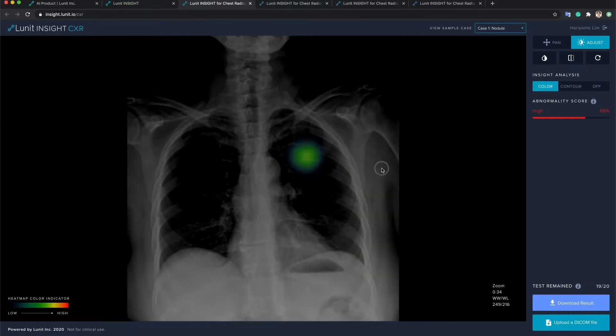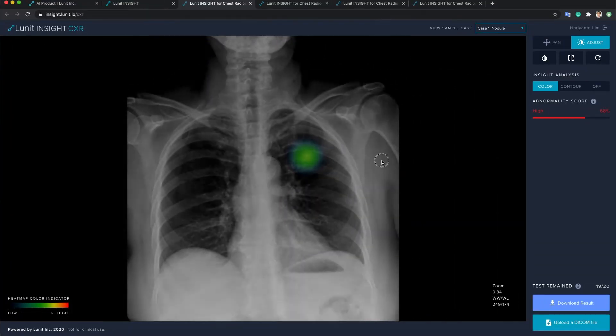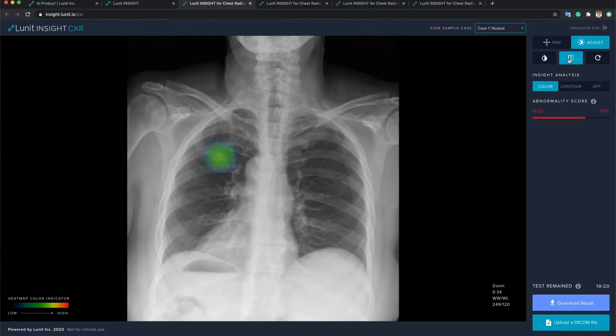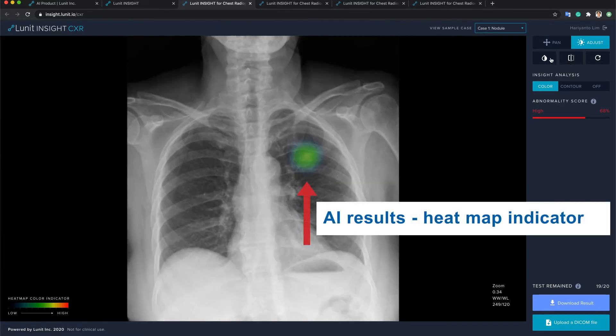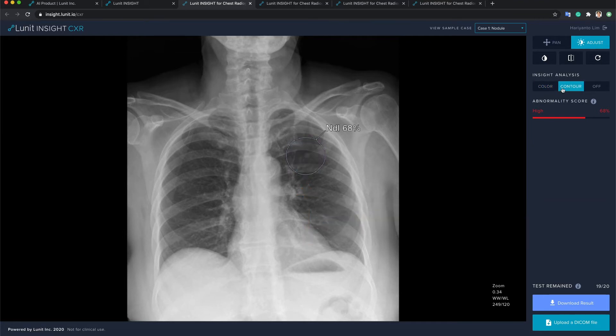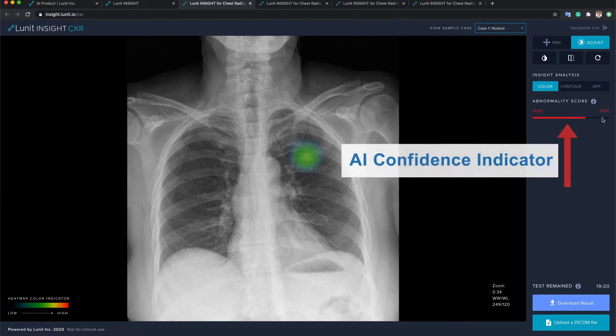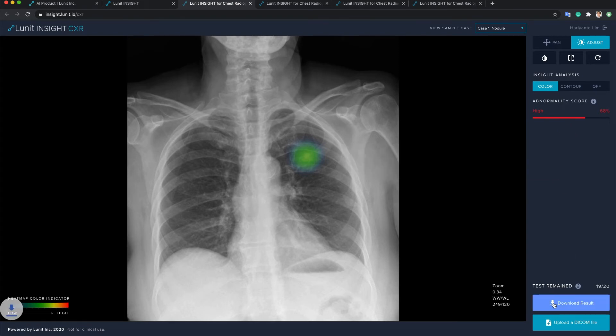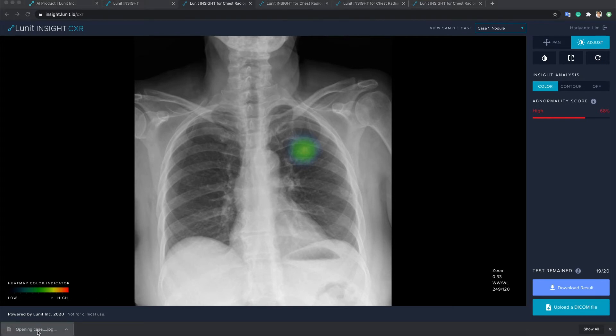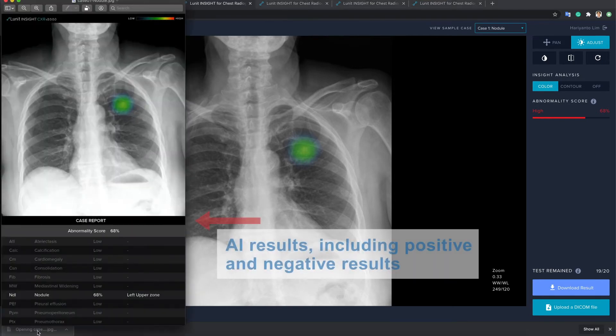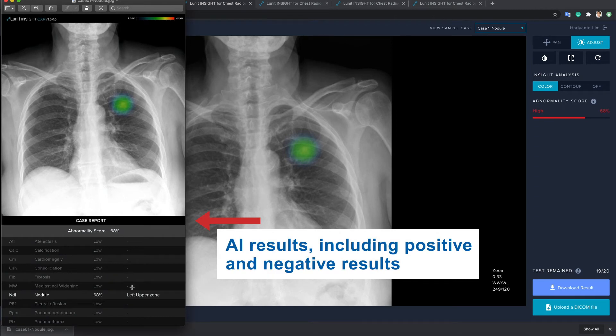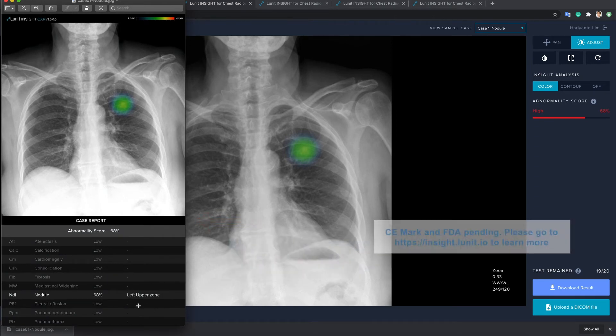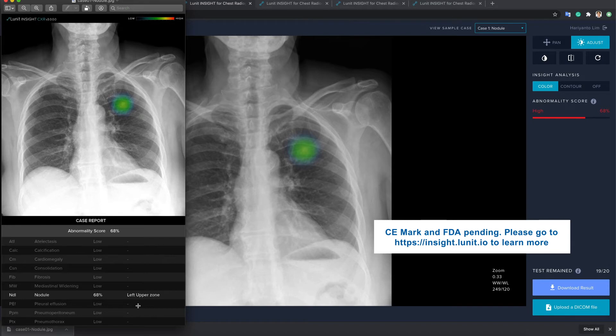Stroke team completes their evaluation of the patient who is admitted to the ICU. While in the ICU, the patient is short of breath, and a portable chest radiograph is ordered. The images are sent to the PACS and the AI platform, which passes off the image data to the Lunit Insight Chest X-Ray AI algorithm. The Lunit AI algorithm surveys the radiograph for multiple findings, including consolidation, pneumothorax, and pleural effusion. For our patient's chest x-ray, the Lunit AI algorithm detected a left apical pulmonary nodule which is displayed. These results are also sent to the reporting system.